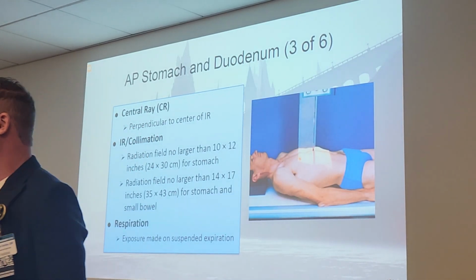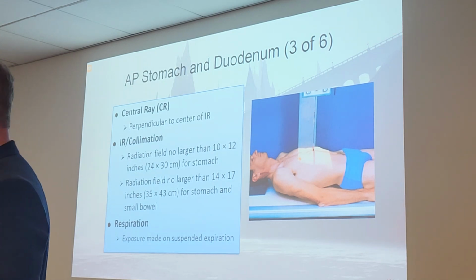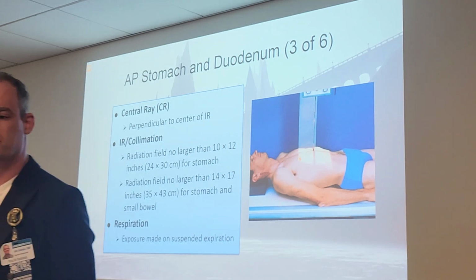Perpendicular central ray, as John just said, suspending on expiration. So all the breathing instructions are the same for all of your upper GI projections. Suspend on expiration.